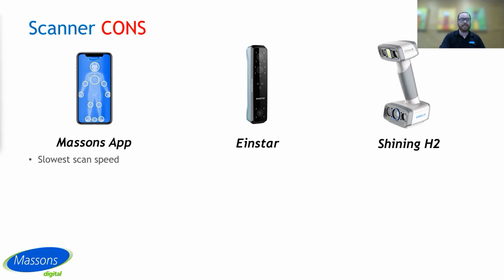So starting with the app, it does have the slowest scan speed of all of them. So you do need to be quite careful and considered while you take these scans. Falling off a scan often requires restarting from the app. This is mostly due to the limitation of it being a phone and having all of the computer software solely for a phone and not an external graphics card or something that can help run it.